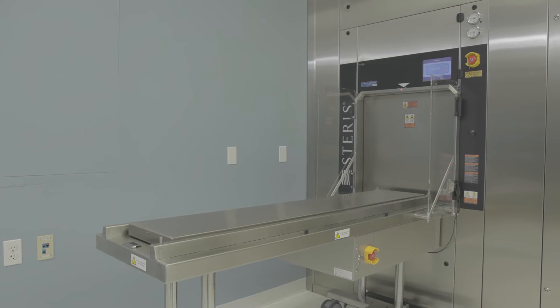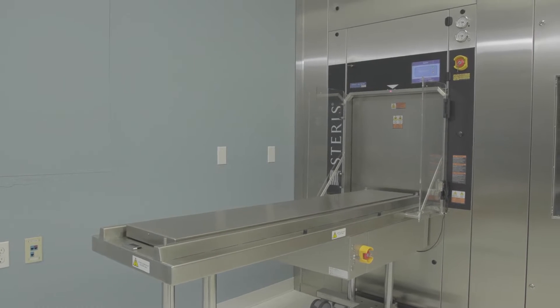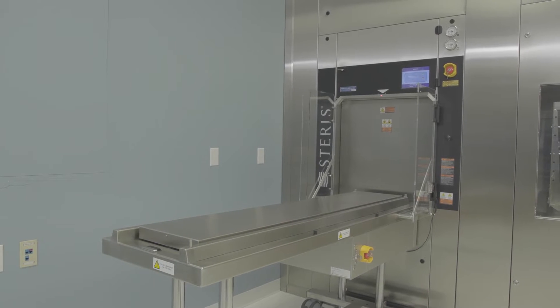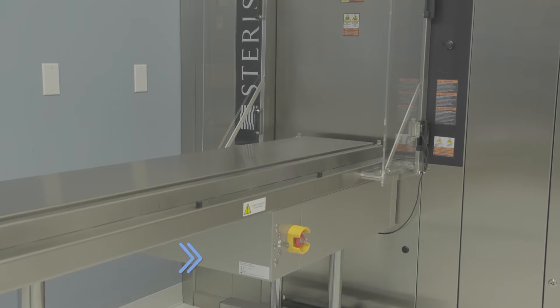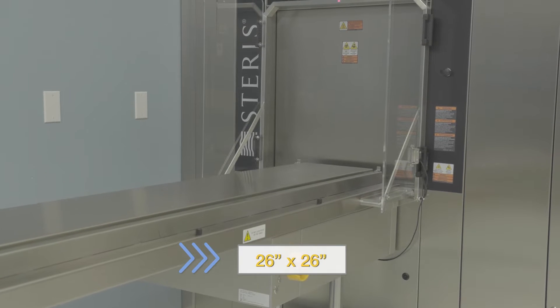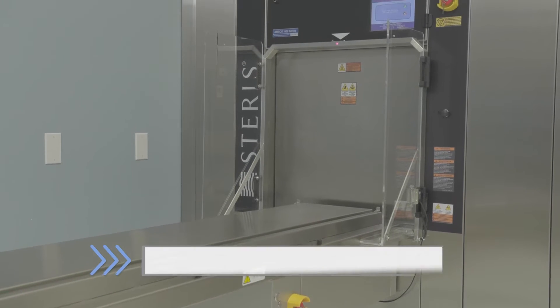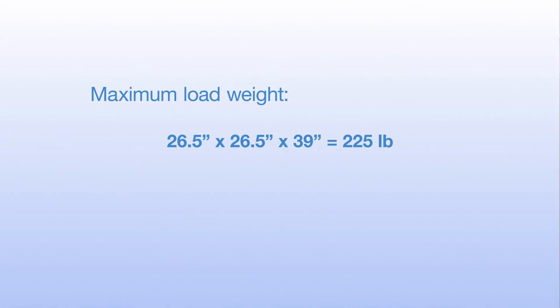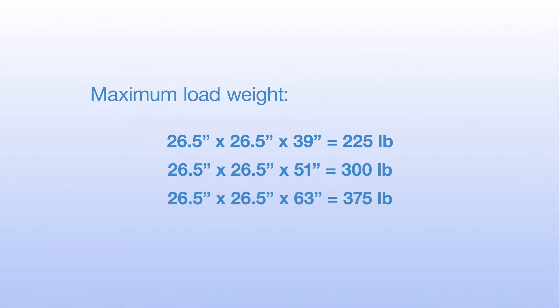The A-LIS is ergonomically designed to help reduce injury risk. The system is used only with AMSCO 600 steam sterilizers with a 26 inch by 26 inch chamber and automated sliding single or double doors. The system can handle loads from 225 to 375 pounds per cycle, depending on the chamber size.